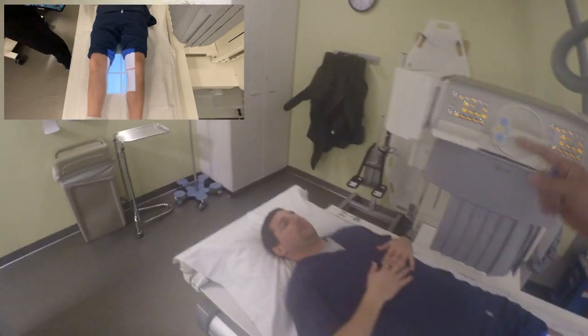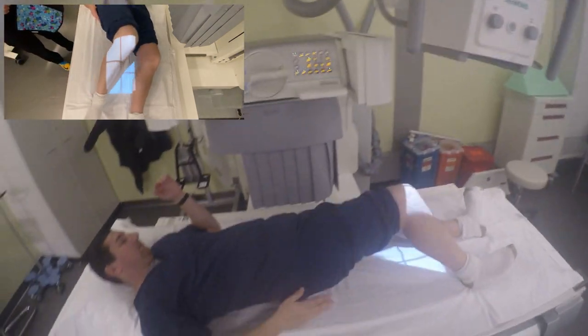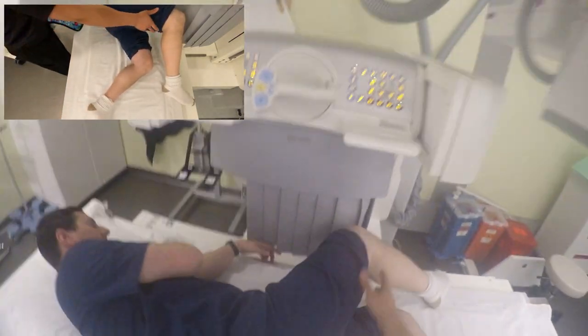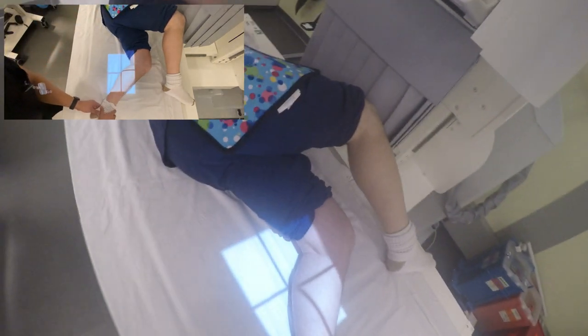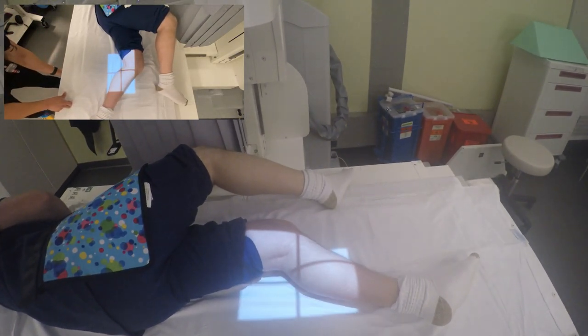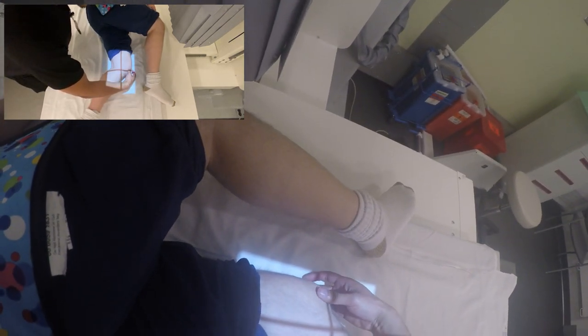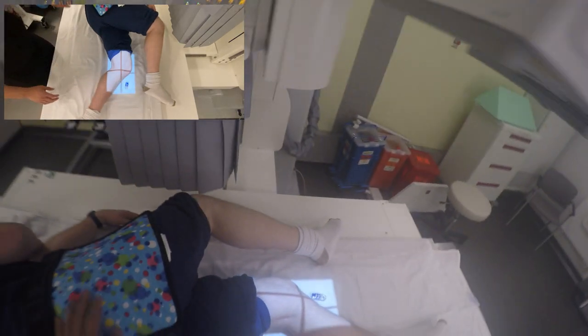Okay, relax. I need you to roll all the way onto your left side, away from me. You're going to kick your left leg behind you, right leg over. Kind of kick this leg back a little bit more — we're going to use this leg as kind of like a kickstand. There you go. Let's straighten this leg out just a little bit more. Rotate your hips forward a little bit. Good, right there.